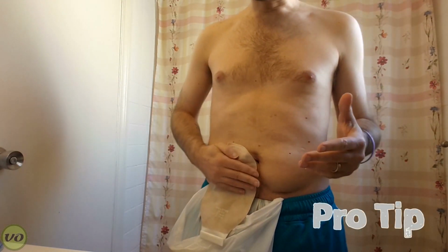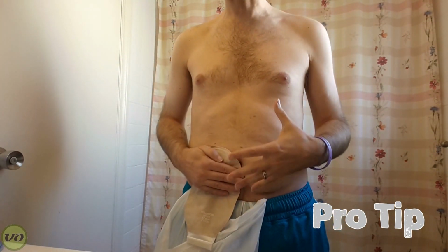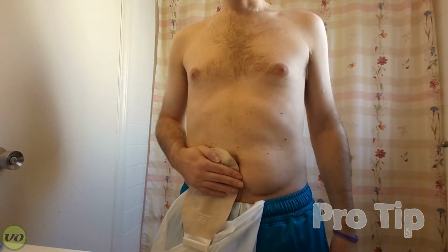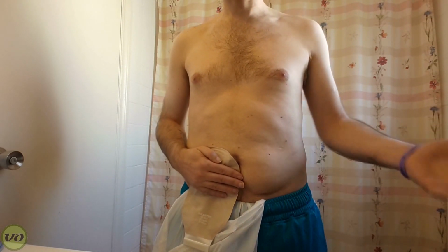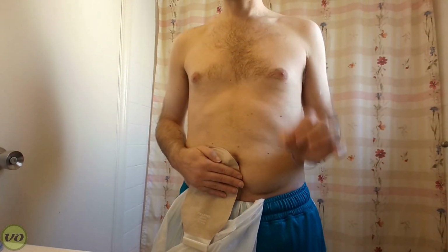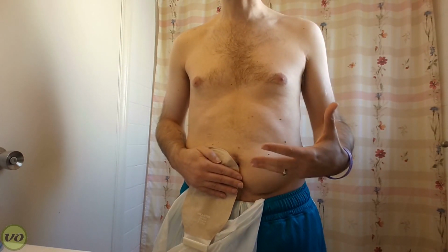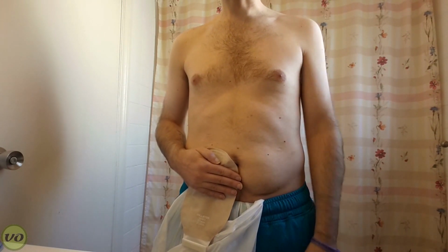And some people like to also just hold their appliance. They get some of the heat from their hand and their body to kind of make the adhesives more active. Again, that's a personal preference. Sometimes it's just out of habit. You do it, and you go with it. And oftentimes you just don't have time to sit there with your hand over your appliance. But for certain wafers, you do have to do that in order for them to adhere properly. So I would follow the instructions that come with your particular appliance and see what they advise. There you go.